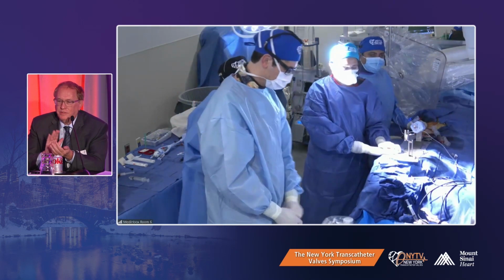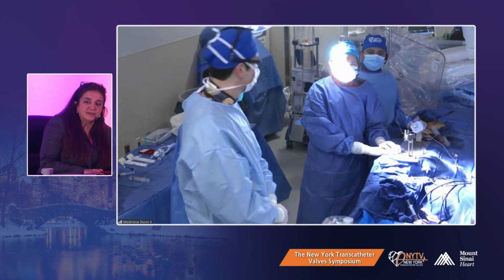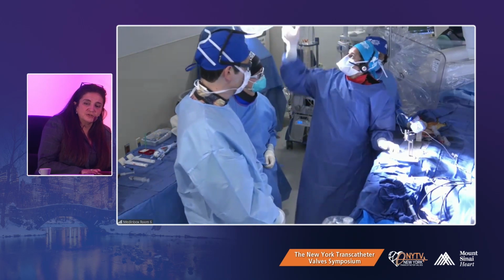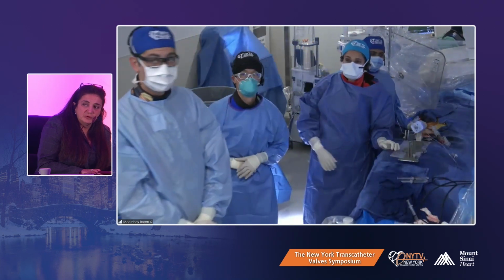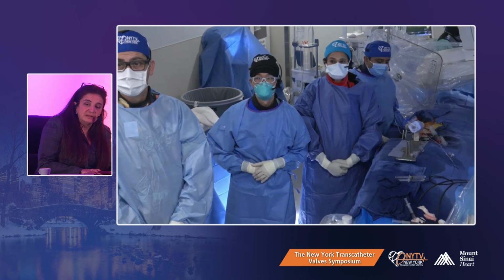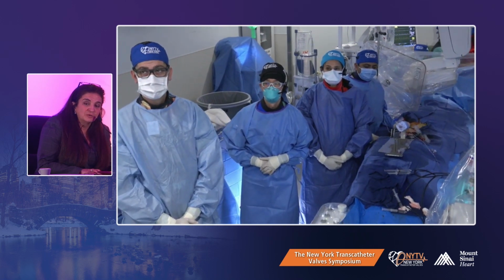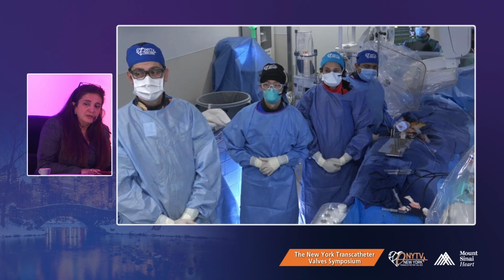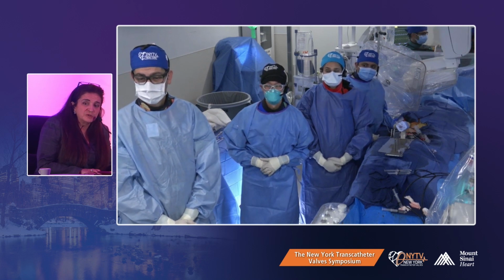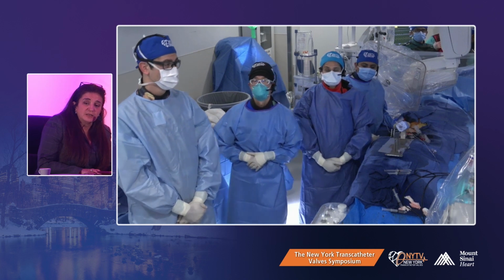So this will be the conclusion of our live case. Thank you, everybody. Congratulations to you and your team, four very, very incredible cases. We started with a valve-in-valve. We did a small annulus and enrolled the patient in the SMART trial, showing the importance of prospective randomized clinical trials and how we can incorporate that in our clinical practice.